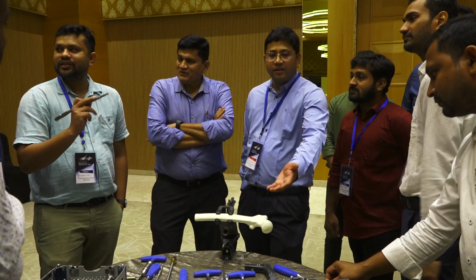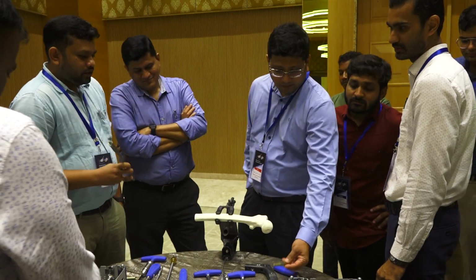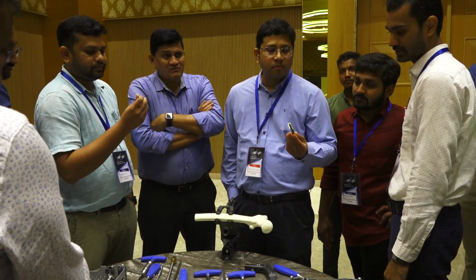Do you have a long nail? Standard nail, PFN. This nail has a very good curvature. That is another advantage of this nail.